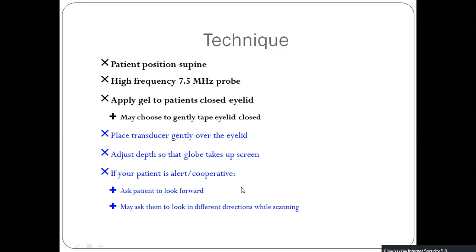Now the technique for measuring the optic nerve diameter. The first thing is patient positioning — the patient should be positioned supine. Use the high frequency or linear probe. Apply gel with the patient's eye closed. You can also apply a tape over the eyelid. Then place the transducer gently over the eyelid. Adjust the depth so that the globe takes up the screen.